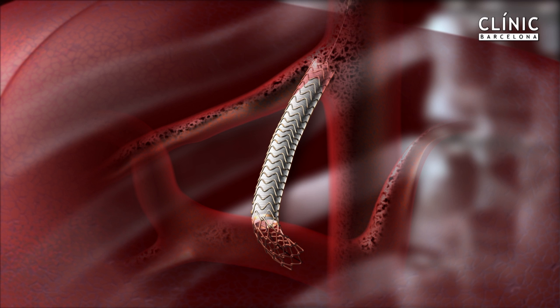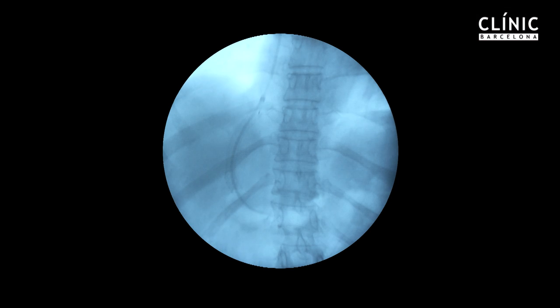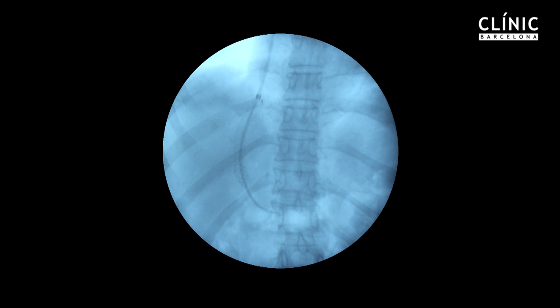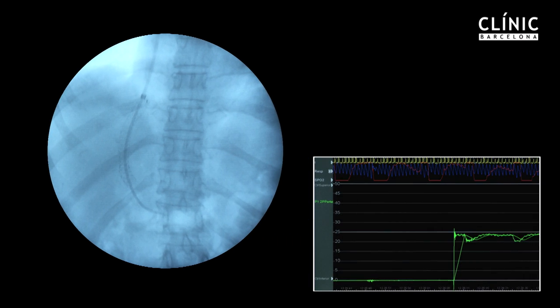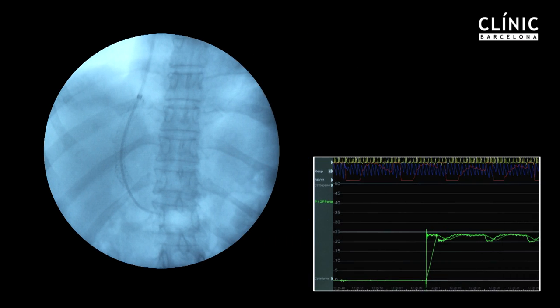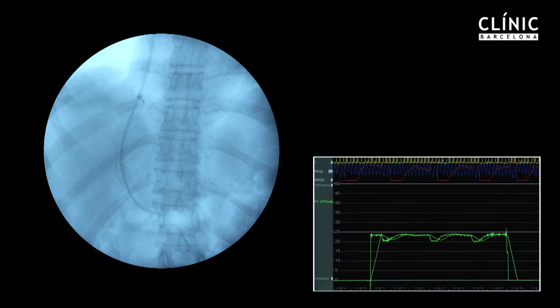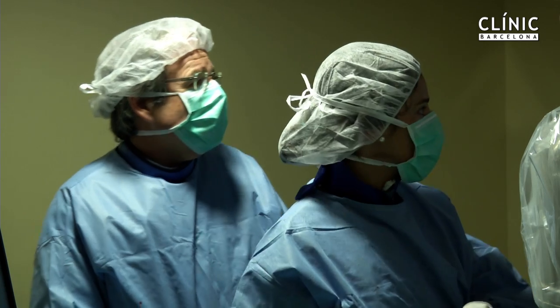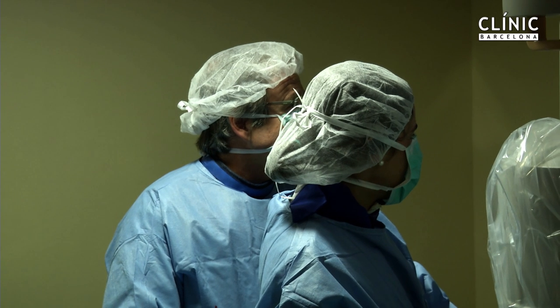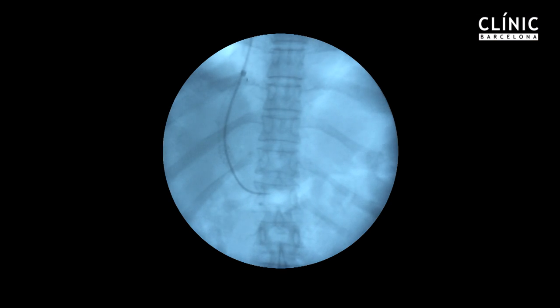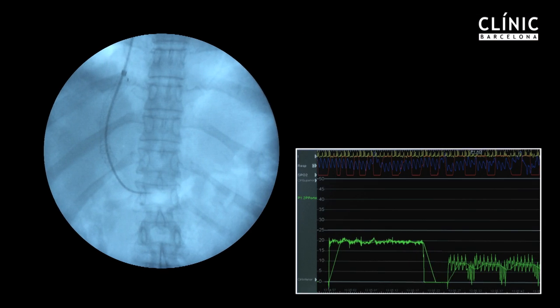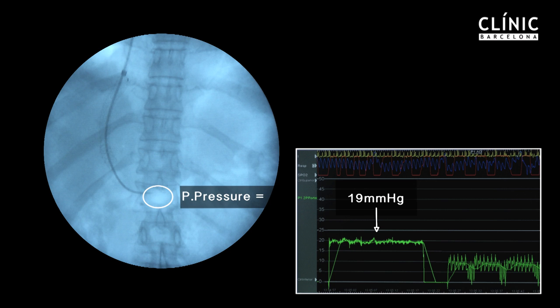Portal pressure is measured, though because the patient is still under deep sedation with important respiratory oscillations, this determination is only indicative. Ten to fifteen minutes after stopping sedation, once the patient is awake and recordings are stable, pressure measurements are determined again, showing a portal pressure of 19 mmHg and an inferior vena cava pressure of 8 mmHg.